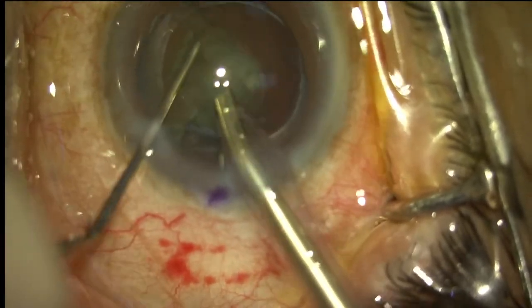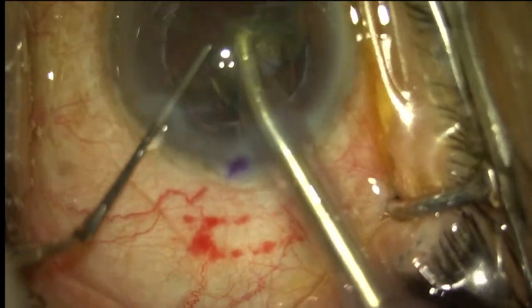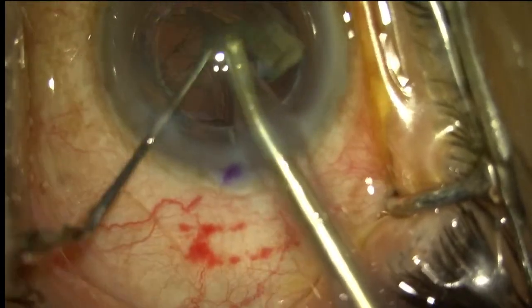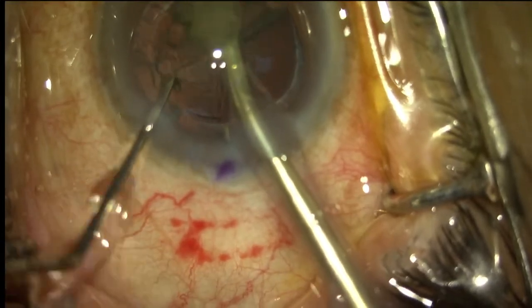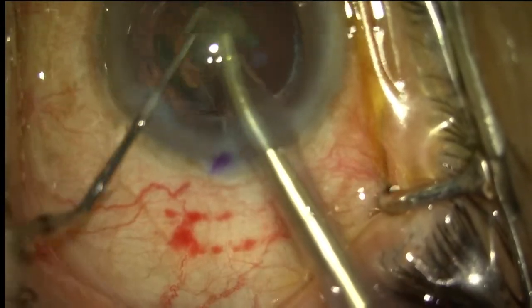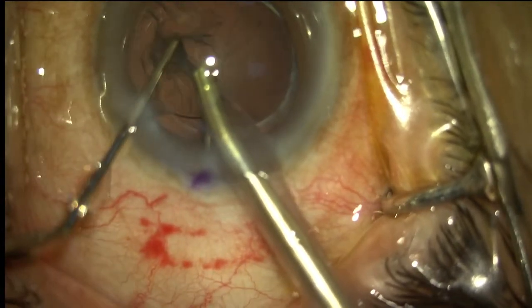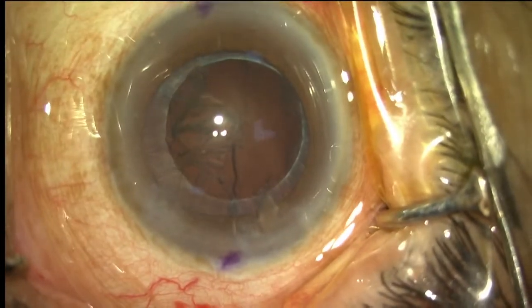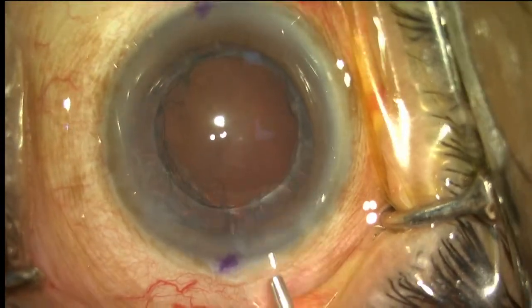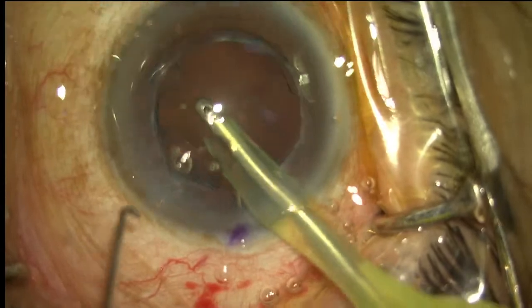So this is the last piece that is left. Since the chamber stability is very good, even at the last piece one need not reduce the parameters. I can safely proceed with the same parameters that I used at the beginning. Cortex. So here I remove the cortical matter.